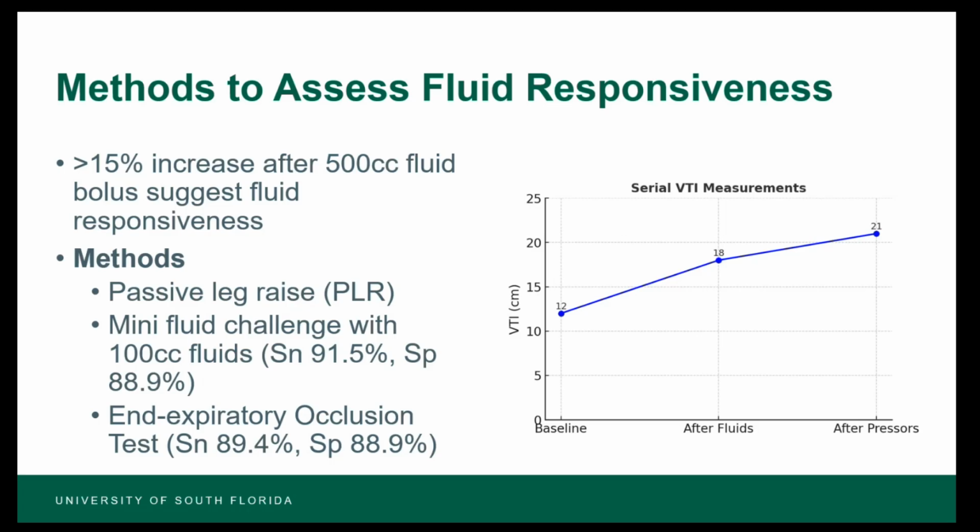And so these are just some methods that are less likely to cause potential harm to the patient that you can use as well to get an understanding of the VTI and whether or not this patient may benefit from fluids or more pressors, exactly.